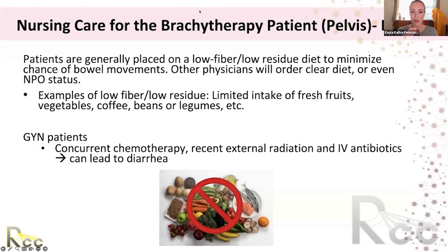But we always will anchor it well. So if they do have to have a bowel movement, we can get them on their side, shield the implant, and have them go in a bedpan. And that seems to work most of the time.